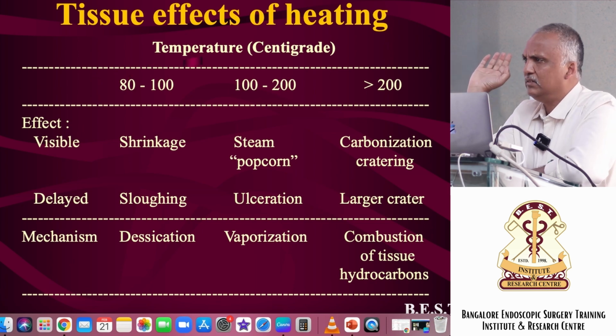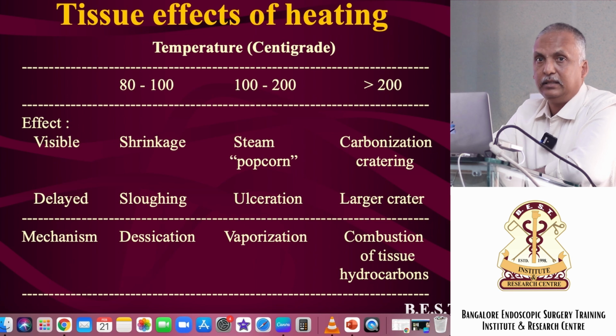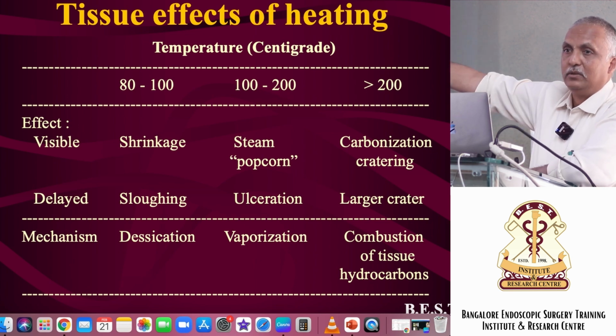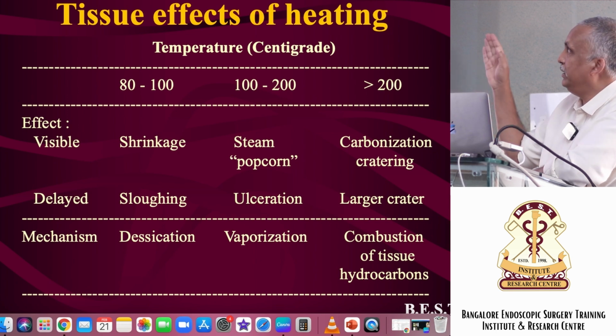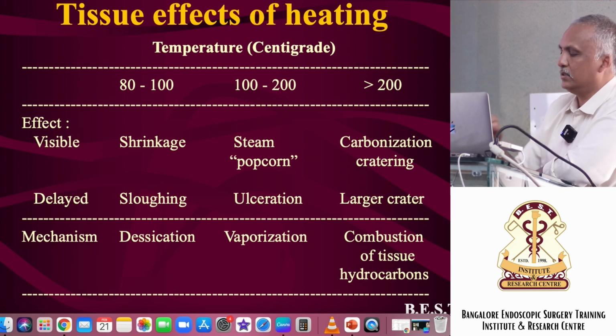At higher temperatures, you are not bothered. Why are you not bothered? Not that it does not cause burns, but it has caused burns in front of your eyes. In the OT itself you have seen the whole tissue has shrunk and then it sloughs off later. There is a huge visible effect. But below 80 degrees, we saw only a little blanching of tissue, and that is what is more dangerous.